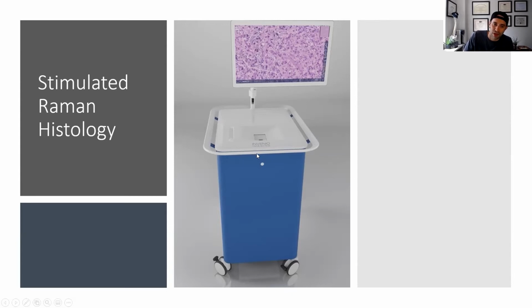And not only that, advances in machine learning, they've looked at, basically, thousands of these images at this point from different tumor types. And it's not FDA approved yet, but it's coming. We trialed it here. We're bringing it in soon. And I was on the first paper out of, I think it was out of Michigan when it came out. The guy's now at NYU.